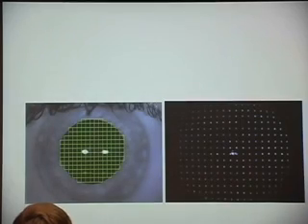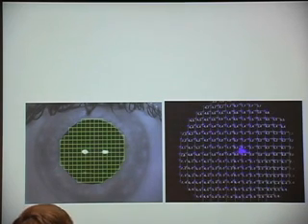So we want to take that and correlate. When you build your sensor, you're taking a normal picture of the eye, and you're taking this Hartmann-Shack picture of the eye, and you want to calibrate it so you know where each of those spots corresponds to in terms of the actual optical eye. That's going to be useful later if you want to use that to correct their aberrations. You need to figure out where each one of those spots belongs.